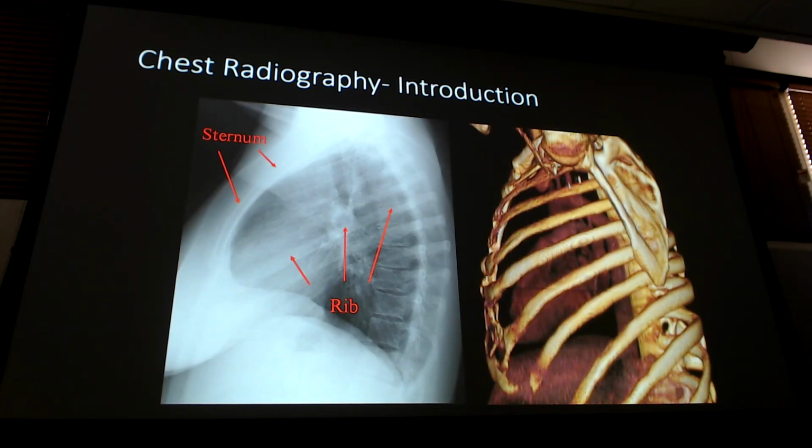Here's a lateral view of the chest. You notice how, on the lateral, I didn't once talk about whether this is an anterior or posterior rib or how to count any of it. Mainly because I don't know where these ribs are up here. There's too much other stuff hidden, like shoulder and soft tissue. And this is just the axillary portion of your rib.